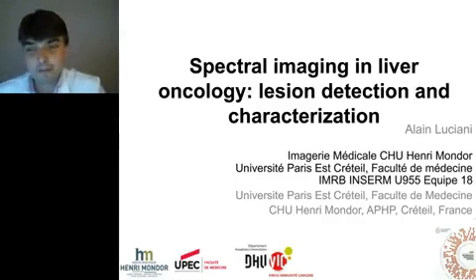My name is Alain Luciani, and I welcome you to this webinar dedicated to spectral imaging in oncology and focused on lesion detection and characterization. I'm a radiologist in Henri Mondor Hospital that's close to Paris, and I'm very happy to be able to discuss with you and hear your questions.